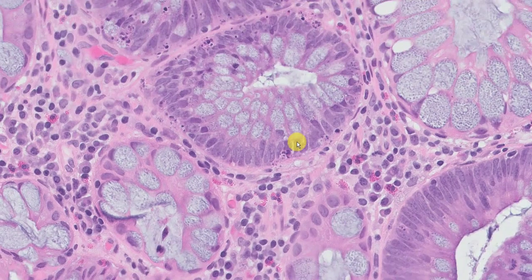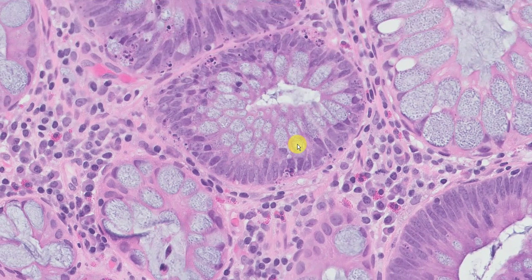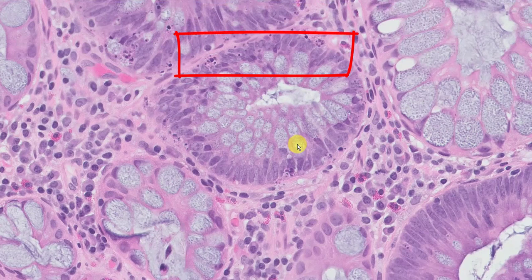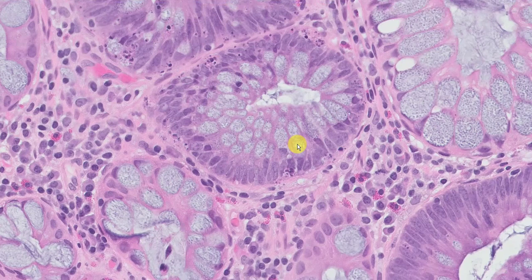There are other features that help, and that is increased apoptotic activity — you will see increased apoptotic activity in an adenoma. I almost think of an adenoma as something that grows fast; if you do a Ki-67 you'll see a lot of Ki-67 staining, and it dies just as quickly, and hence many of them are eliminated over time. Very few adenomas actually progress to cancer. And here's the apoptotic activity. In subtle situations where the atypia is very subtle, I will use apoptotic activity to support and buttress my diagnosis of an adenoma.